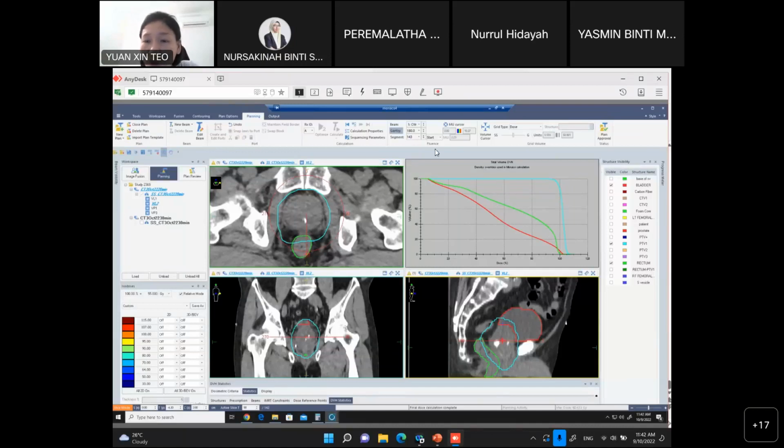By using this protocol, we make sure the patient's bladder is extended. This helps to reduce the bladder toxicity while we push the bowel, the small intestine, superiorly. So this will reduce patient side effects, and we reduce the chances of diarrhea.